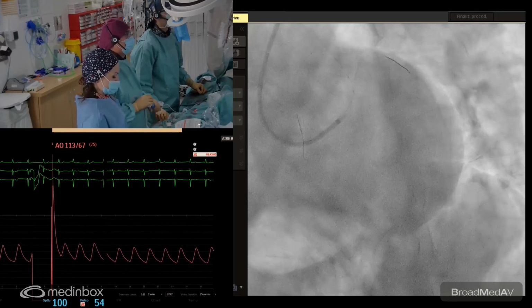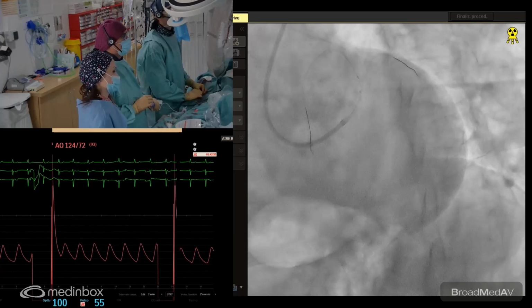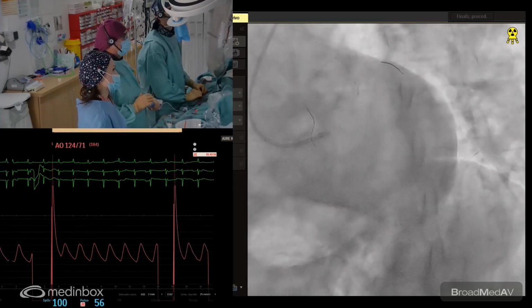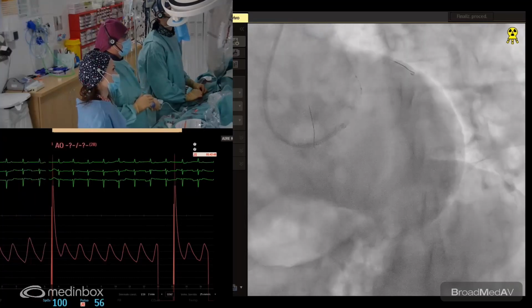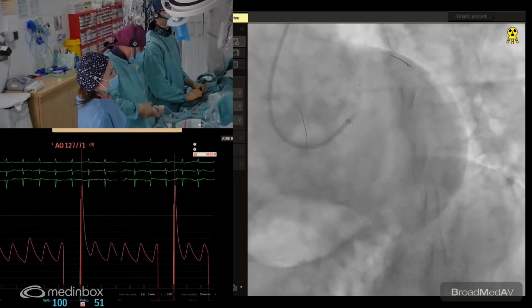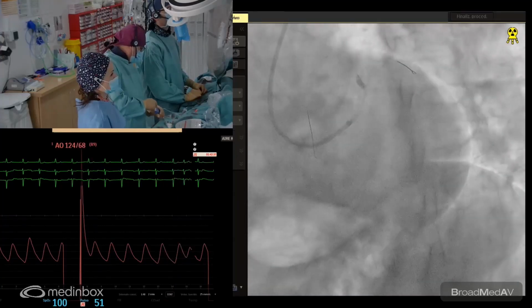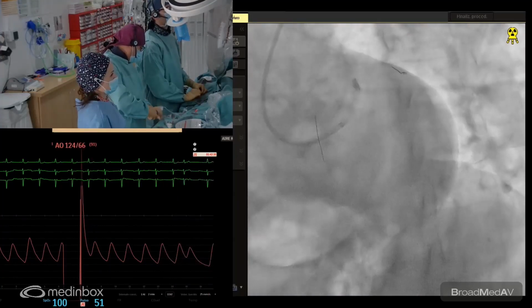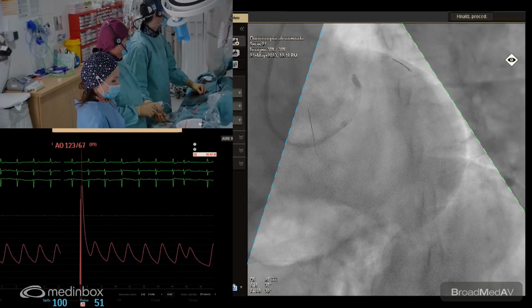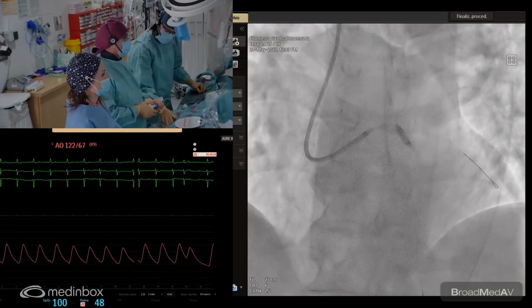Give me a test, please. Wait a minute, just to be sure not entering in the left main. Test, please. Probably a little bit more distal. Test. Okay, there. Okay, up. Look at the small space we have between the circ and the first diagonal. Because the wire is in the second one. Okay. Very good expansion here. And also here. Okay, down.